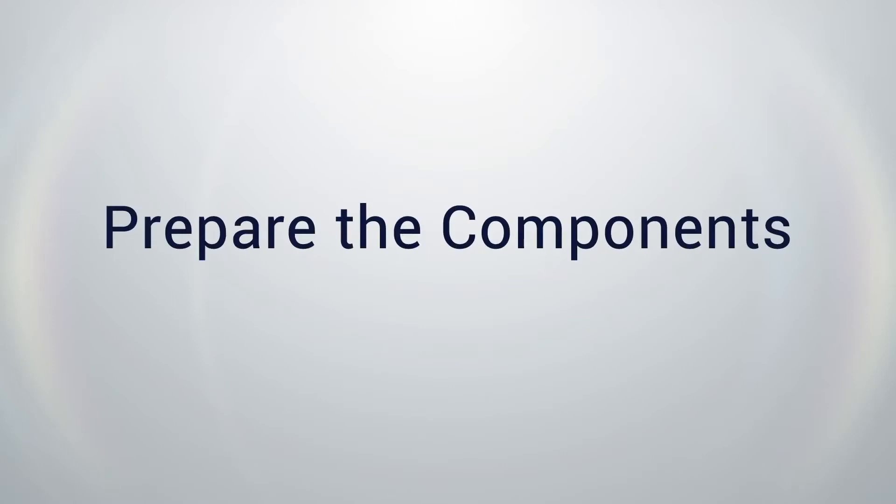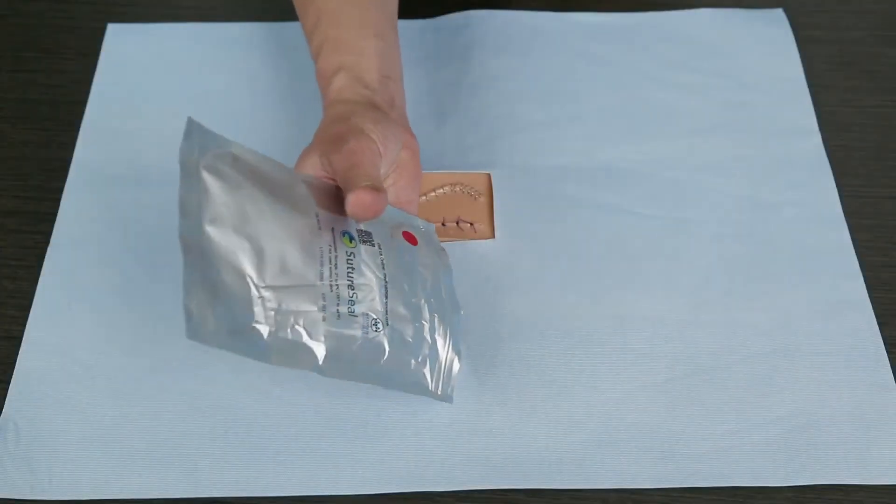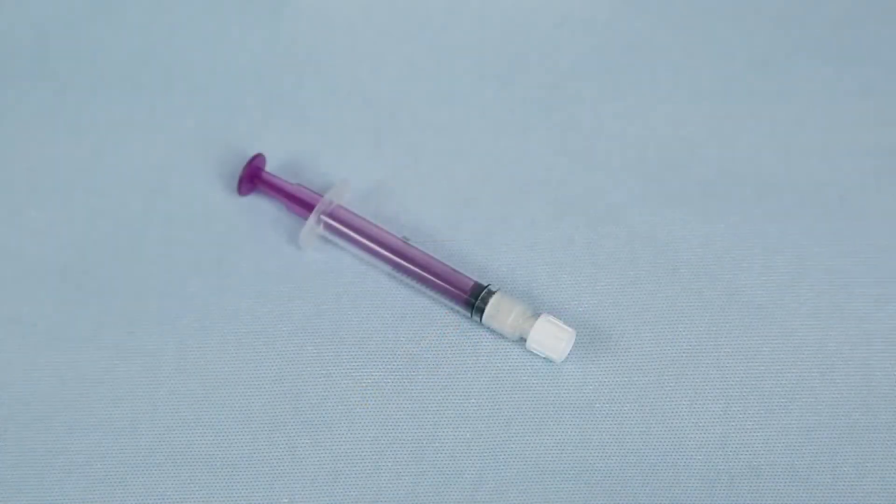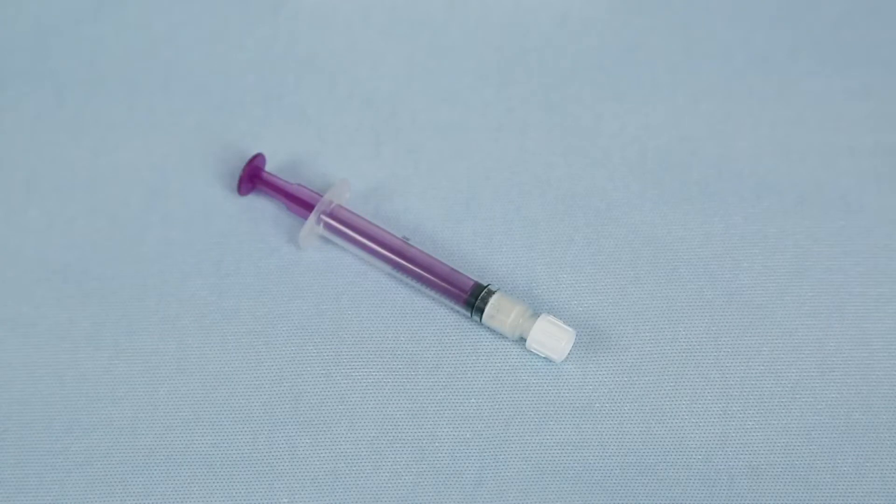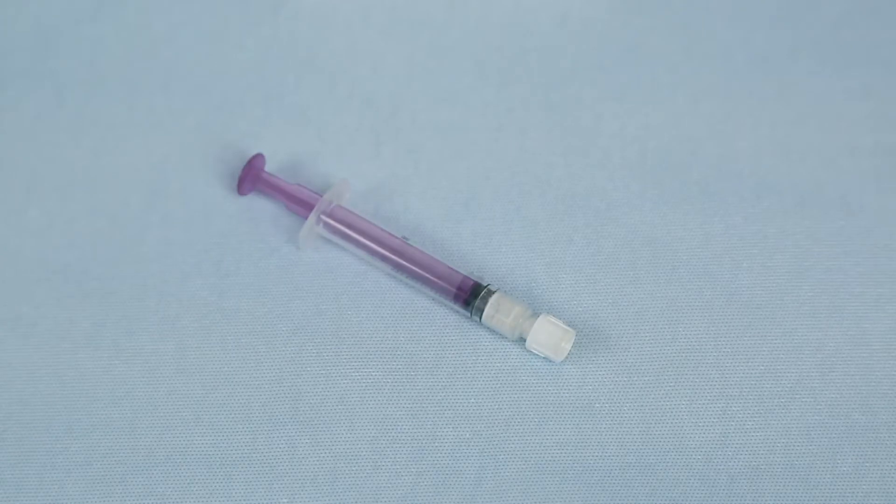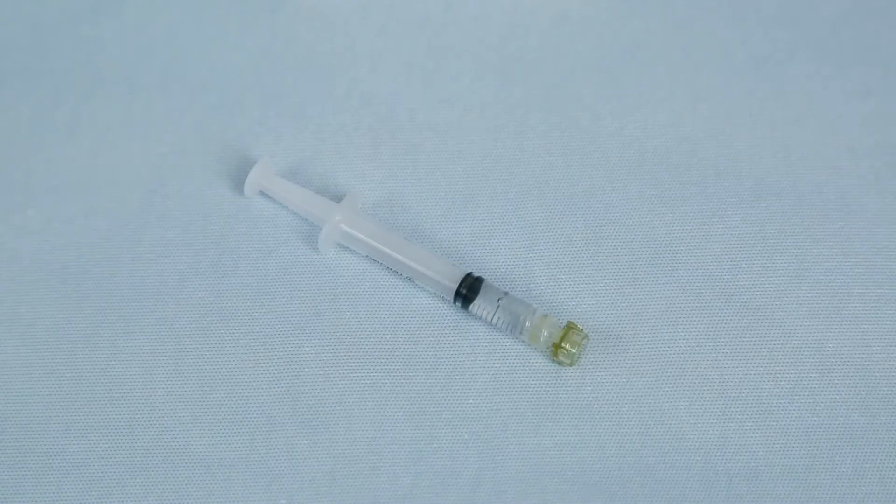The first step is to prepare the components. Open the foil pouch and remove the three components: two syringes and a tube case containing the application brush. One syringe is a 2.5 milliliter syringe containing 50 milligrams solid white powder hydrogel polymer, and the other is a 3 milliliter syringe containing liquid phosphate buffer solution.